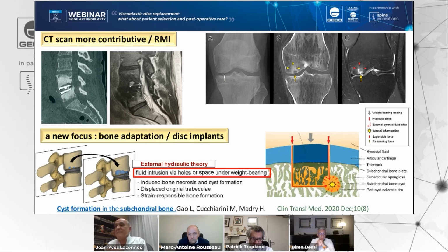And this may induce, as a consequence, the creation of those bone losses. So we must be very careful in the preparation of the end plate. And in my experience, the inferior end plate of L4, for example, or the inferior end plate of L5 are sometimes difficult to prepare because we don't see those end plates very well during the surgery.